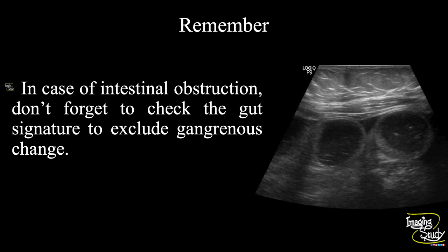Now the take-home message. In case of intestinal obstruction, don't forget to check the gut signature to exclude gangrenous change. This is a common thing that we miss during our regular intestinal obstruction cases.